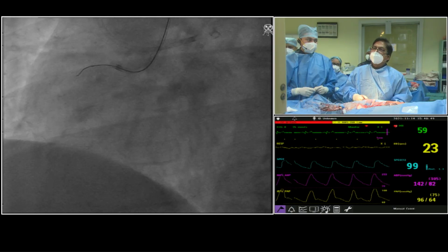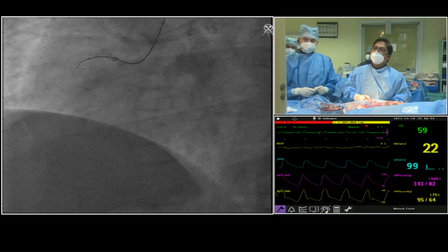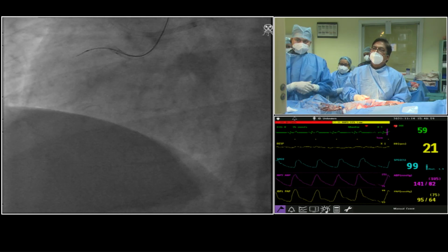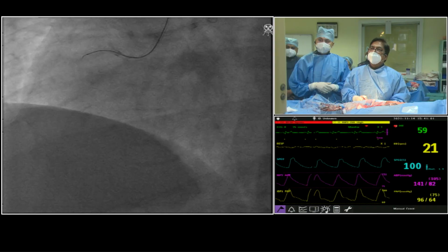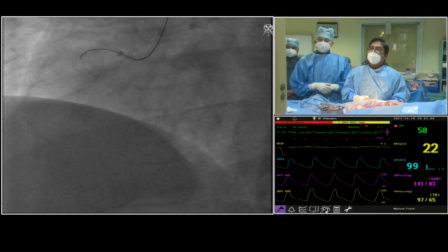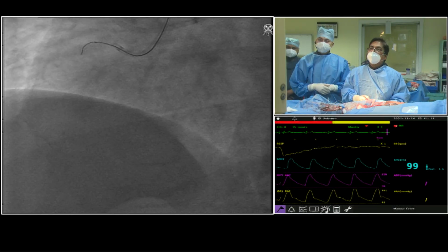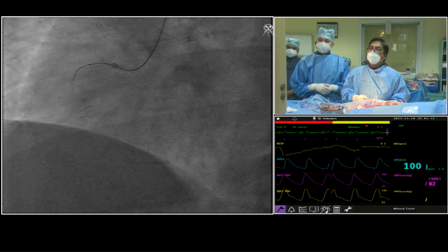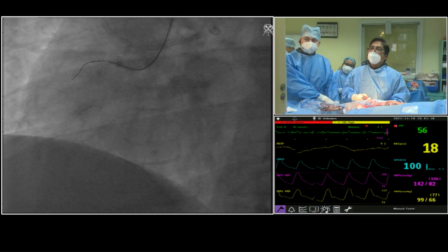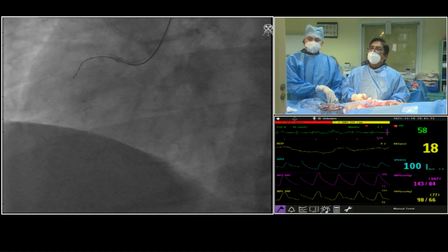I am pushing very hard against the plaque, but it is not moving forward. I think Goel sir actually. So how long do you spend time with your wire before you escalate again? What is your normal conventional time frame? It depends. Not too long. At the same time, sometimes you may think that you are crossing. Now there is definitely a progress. Progress created, no doubt about it. Definitely, yeah.